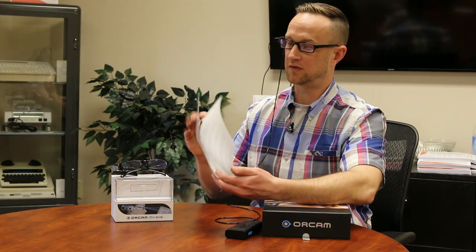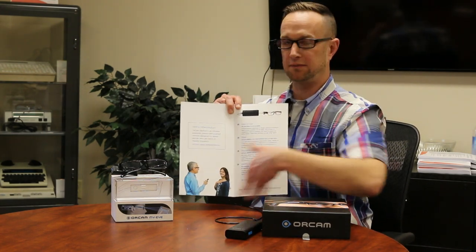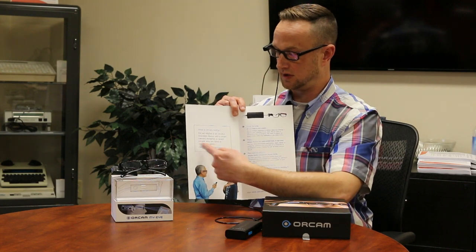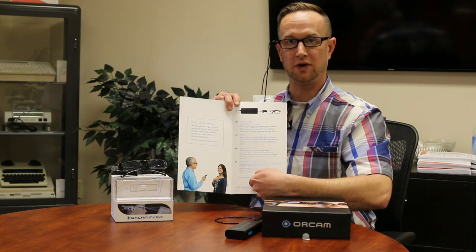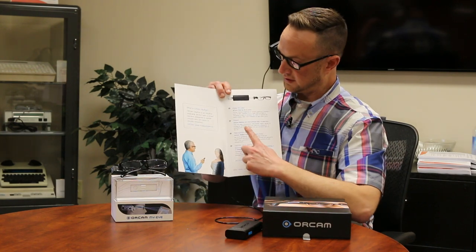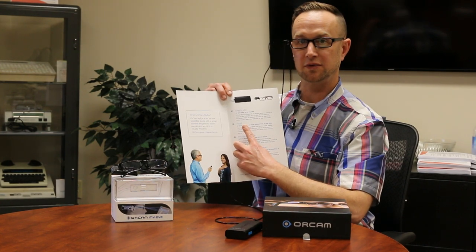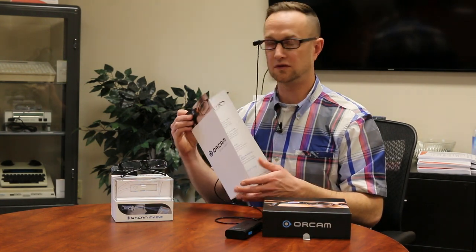It has a finger gesture that can also initiate reading. You can hit the trigger button and it will read the entire document from left to right all the way down. But if you want to read a specific paragraph, you can use the finger gesture — point right under the text, it takes a picture, you move your finger away, and it starts reading right where you pointed.